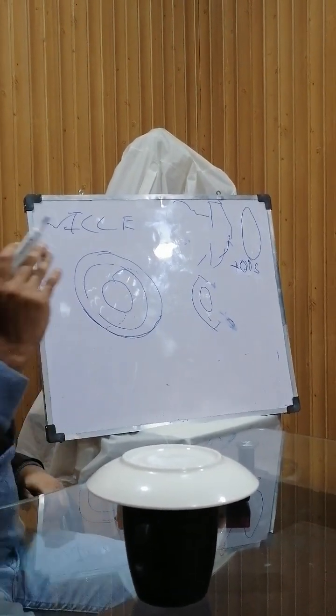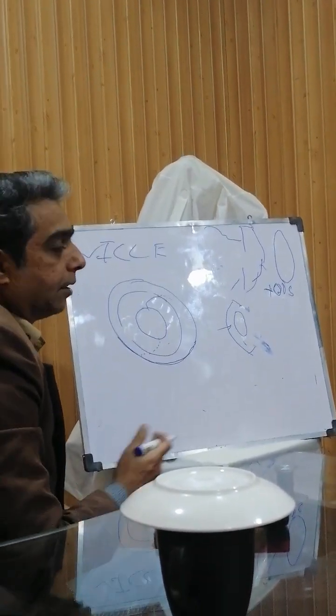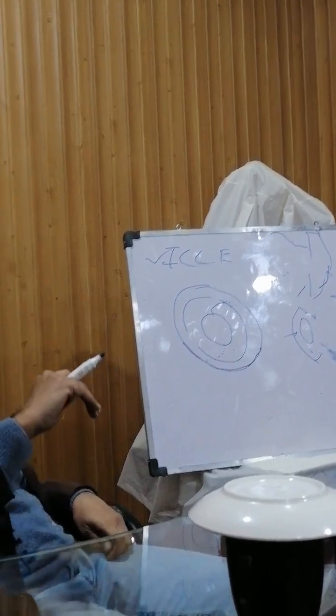If, for example, one of the disastrous complications occurs, that the posterior capsule is ruptured during surgery, then we cannot implant the lens. So overall the concentration during the cataract surgery, because we are doing the cataract surgery on a normal eye, and if there is some pathology, for example retinal detachment, then we have already lost many things. That is a diseased eye. But in cataract, you are operating on a normal eye. If you lose something like posterior capsule rupture, then you lose many things on patient's behalf. So to do surgery on a cataractous eye is a very tricky and very sensitive business. It has to be done very, very carefully.